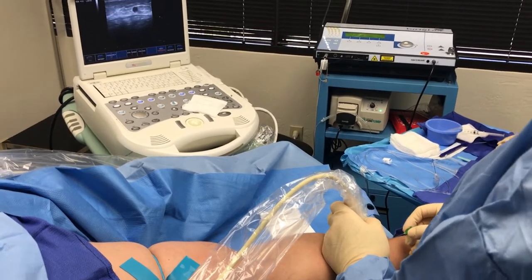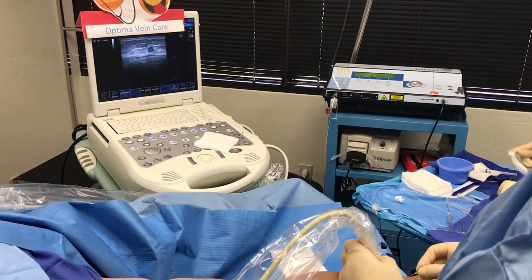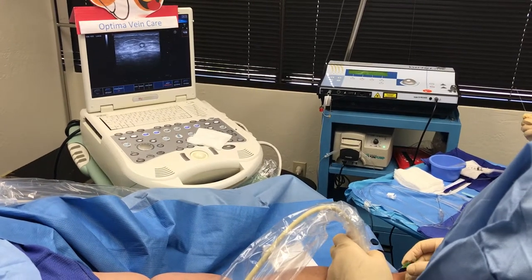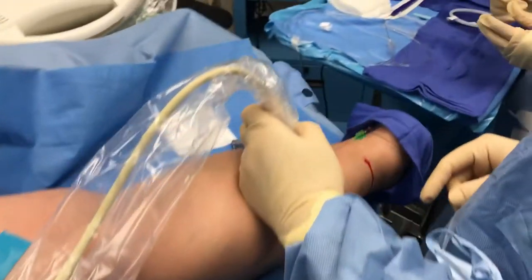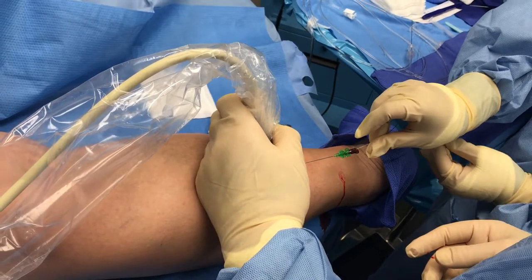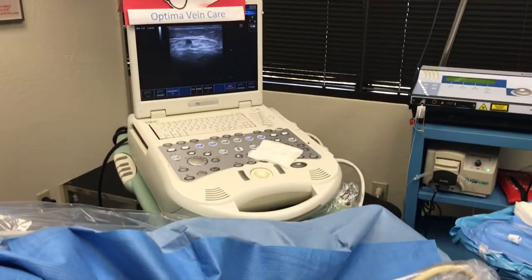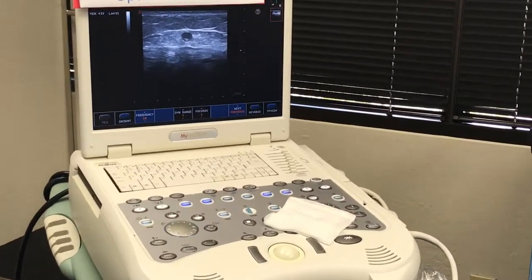The next job is to try and get a needle into that structure. We'll advance the needle. You can see it comes off — if you look down here with the camera it's bleeding back, so we're in the right spot. We'll feed a wire into that. You can see the wire going in, and we'll advance the wire further.